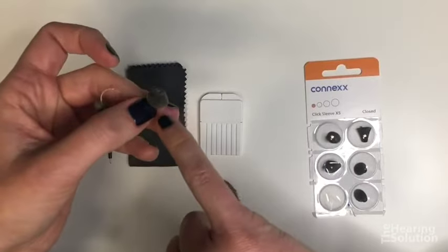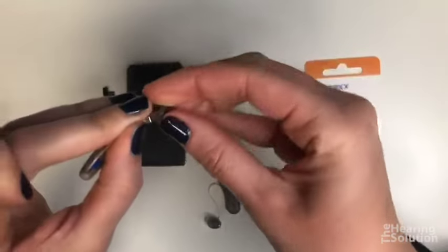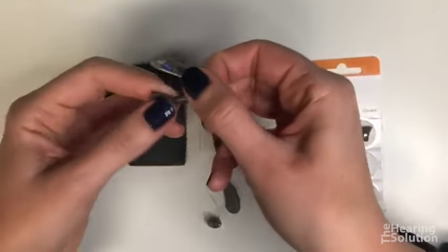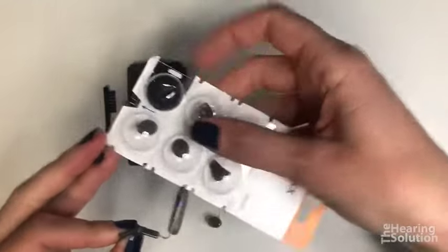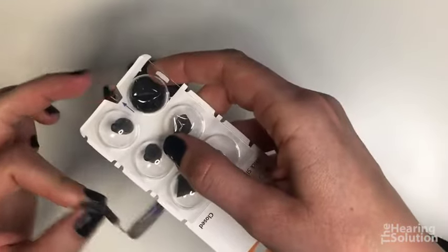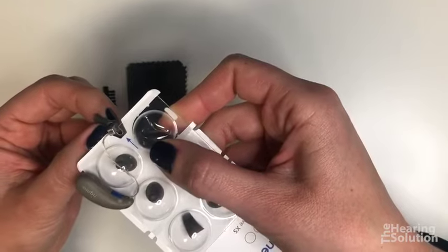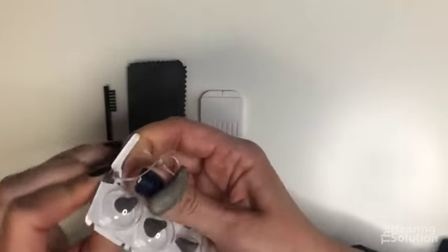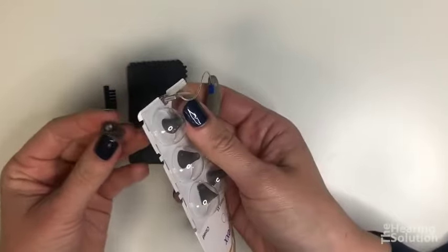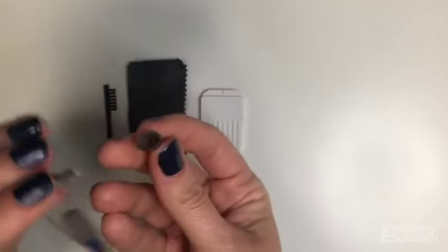Now occasionally you may need to replace this dome, and the way that we do that is if you peel this back, you want to see the junction between the dome and the speaker wire. You'll take your package of extra domes and you'll see a blue arrow, and right next to that blue arrow is a little plastic junction. If you insert this in between the dome and the speaker and pull like that, they'll come apart. So then you can throw your old dome away, pull a new dome out of your package, and it will just insert straight into that hole.